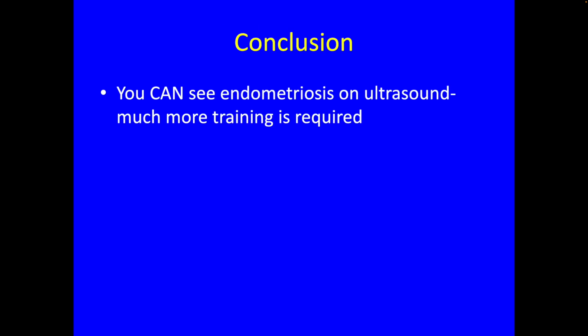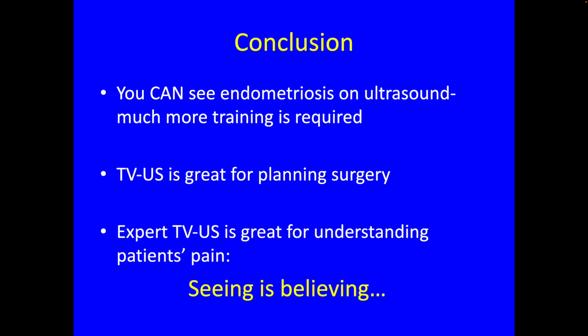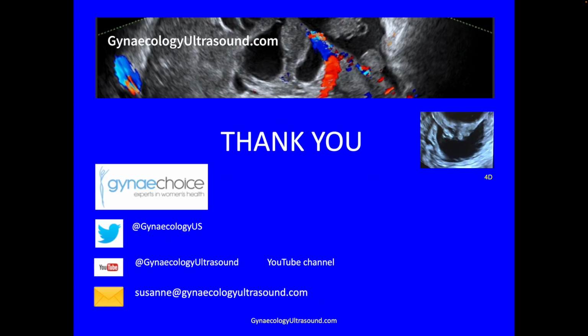So in conclusion, you can see endometriosis on ultrasound, but a lot more training will be required before it can be done by everyone. Transvaginal ultrasound is great for planning surgery, and expert transvaginal ultrasound is great for understanding patients' pain. Seeing is believing. Thank you.